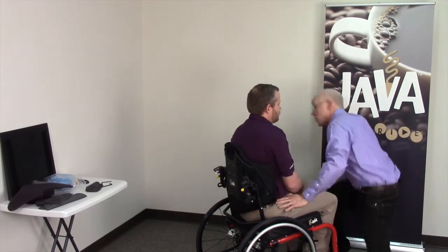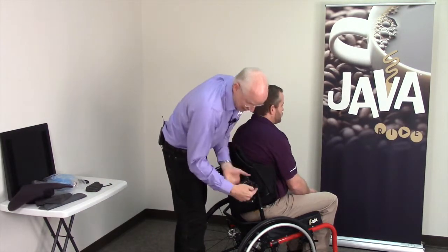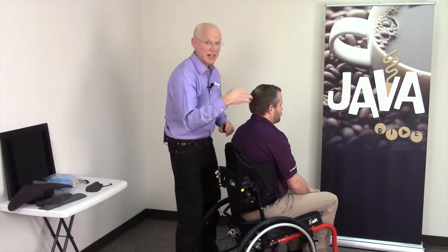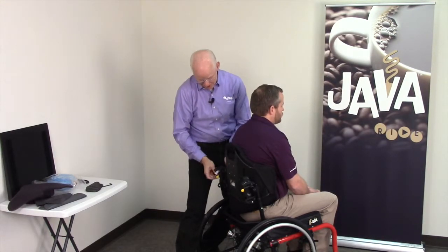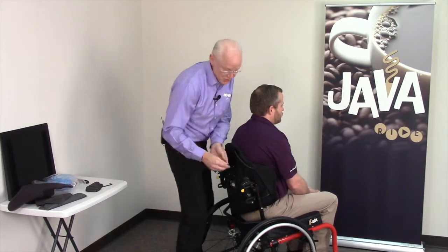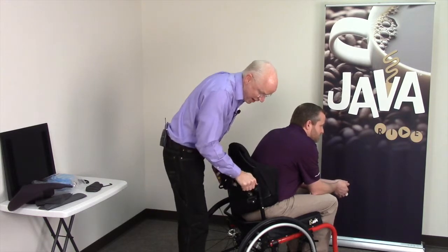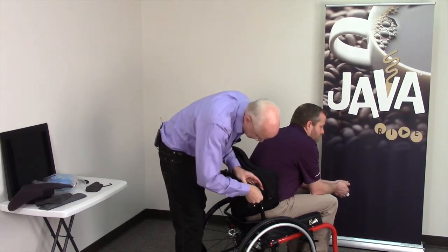All right. So once again, I'm going to get my Allen wrench, which comes with the back. I'm just going to loosen my clamp that holds the hardware to the chair. I'm going to loosen both clamps. Look at this. It's loose. Client is safe. Now I've got my clamps loose. It will be easier to slide the back down if Ryan can be leaned forward. So with him leaned forward, I'm going to take my back support and lower it to my desired height.